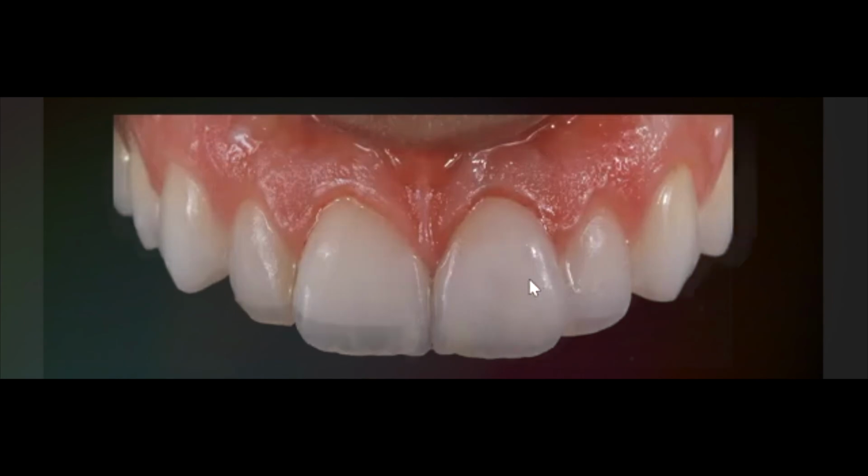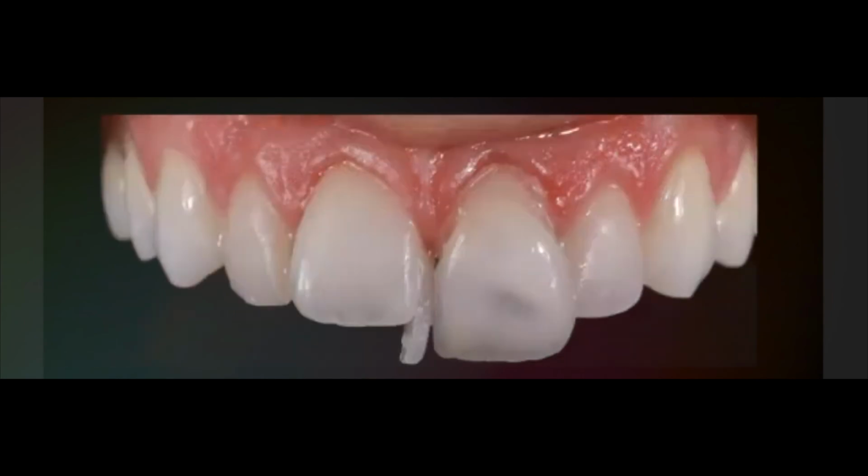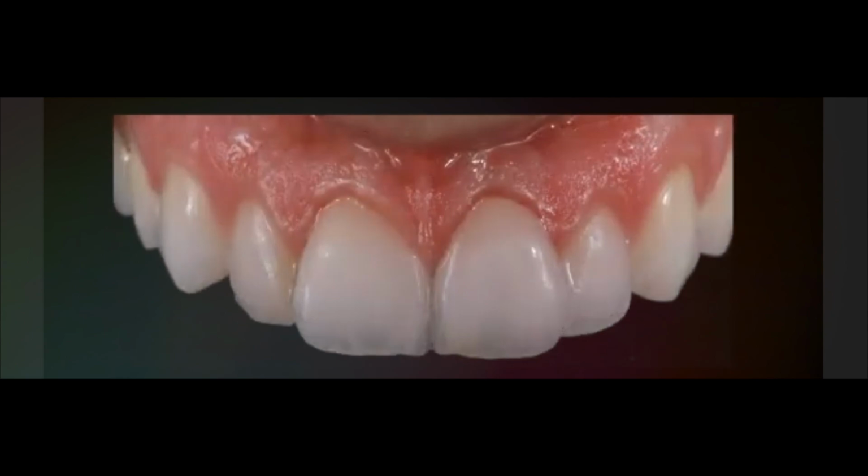Going back and forward, and you can see now it becomes more pink, like the natural central. It's quite difficult. Seems easy, but it's not. Maybe you need only 5 powders, but for me it's the most difficult single central. Very bright, young, with a lot of translucency and opalescence.